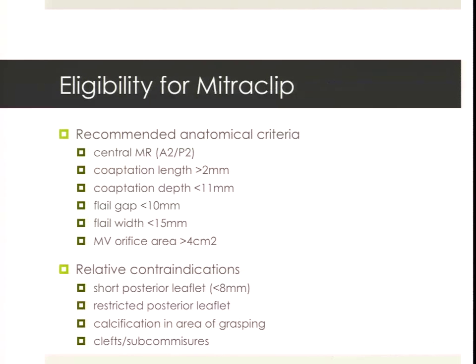At the back of our mind, when we're doing that pressure half-time, there are those eligibility criteria that have already been addressed about MitraClip. So if you say, oh, well, I think this person's got ischemic MR, but it's only probably moderate, or we think it's only mild to moderate, can we address them down the line? There's not much point saying, well, I'm going to address them down the line with a MitraClip if they're never eligible for a MitraClip to start with. You might want to force your hand and talk about doing something about it there.